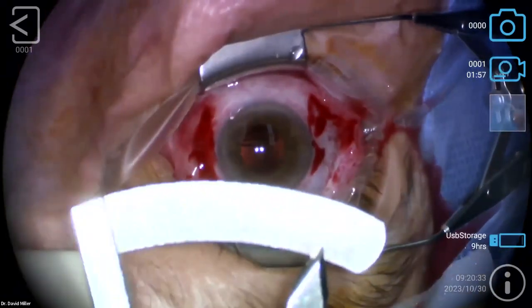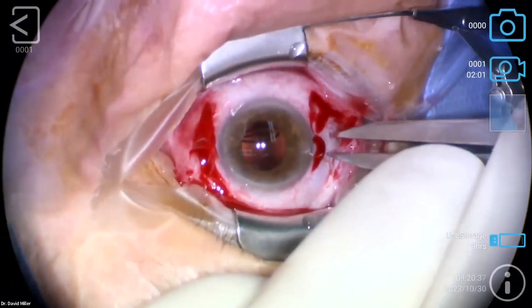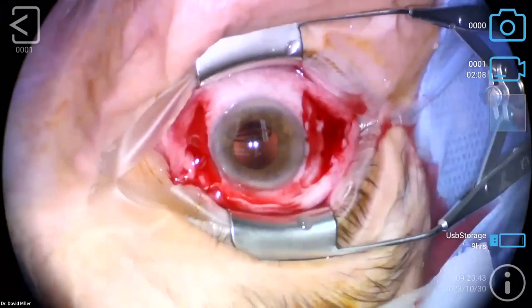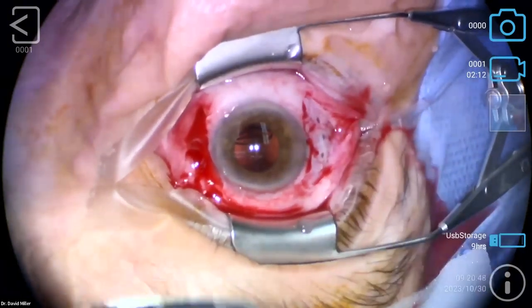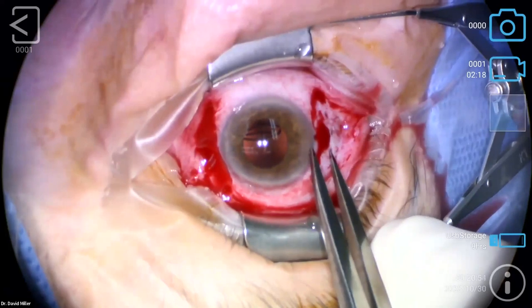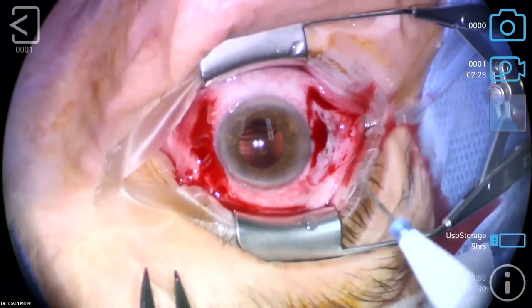Then we're gonna go to 2 here. That didn't look right to me. Always make sure it makes sense. I thought I had it at 2 and I did not. So we're gonna measure 2 millimeters to each side of that middle mark. So I got potential sclerotomy incisions right there. We're gonna confirm that they're 4 millimeters back. Again, 4 to me is really key, having had troubles with recurrent CME. I'll take a trocar and a cannula here. And we're going to put this one in.